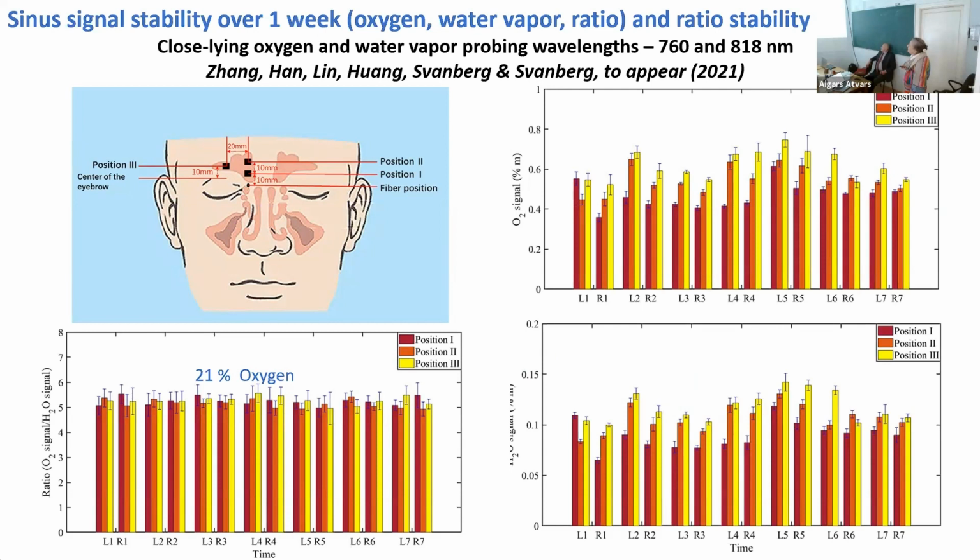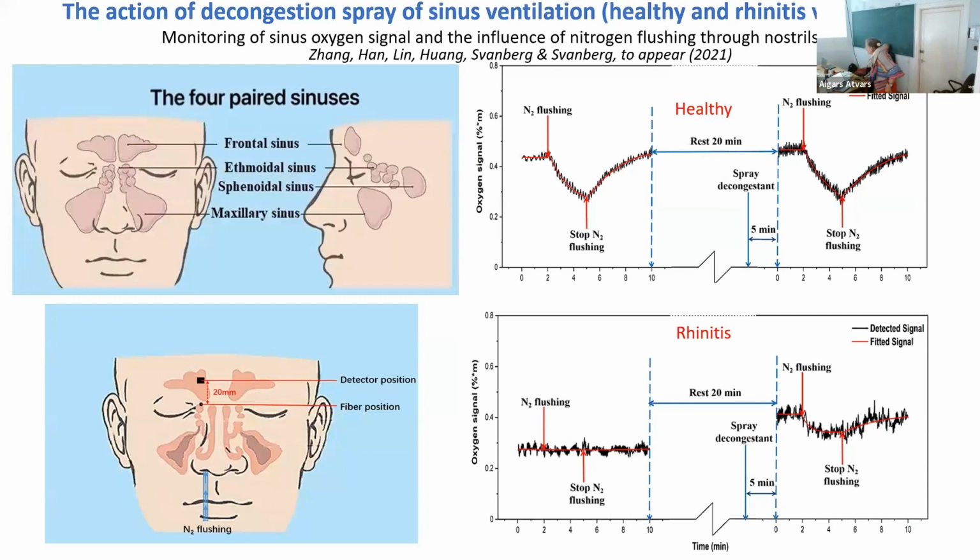Together with the Chinese students, we investigated the stability of the technique. You see that also over the day or over a week, we had quite good stability. So we could make up a baseline for each patient. Here we see what I said, which is important: to see if the channels are open. Because if the channels are open, the sinuses will empty themselves. But if they are closed, of course, there is an inclusion inside the volume, and that can cause problems.